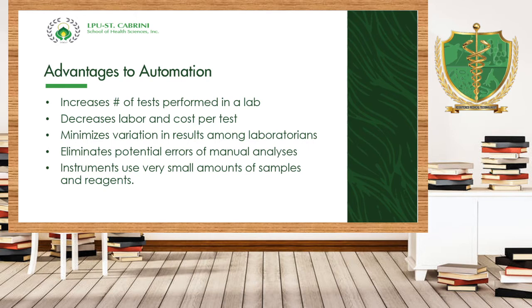In clinical microscopy, one of the tests is the urinalysis, or the microscopic examination of the urine, wherein some laboratories are still offering the manual one.